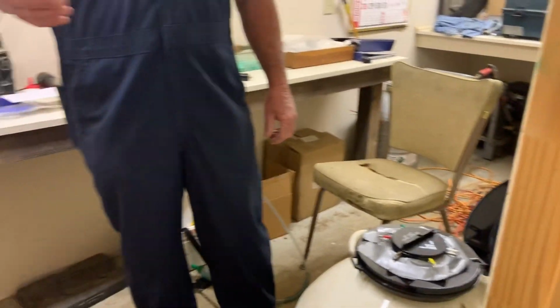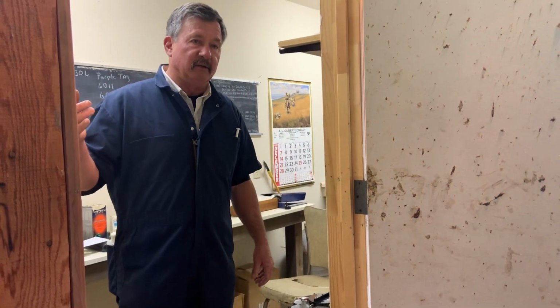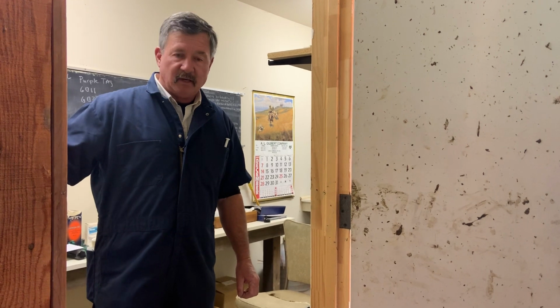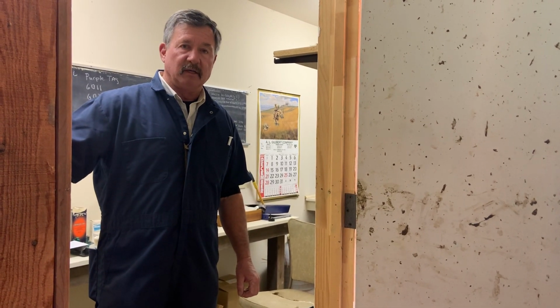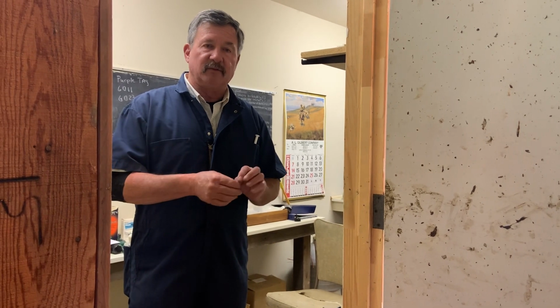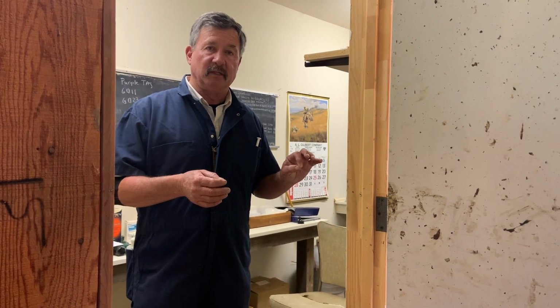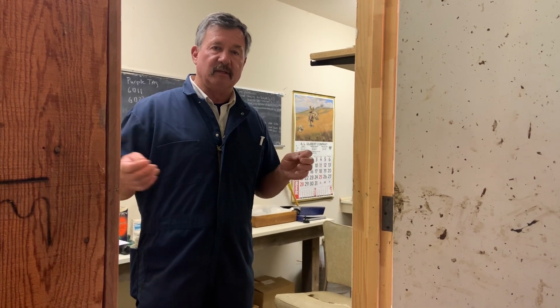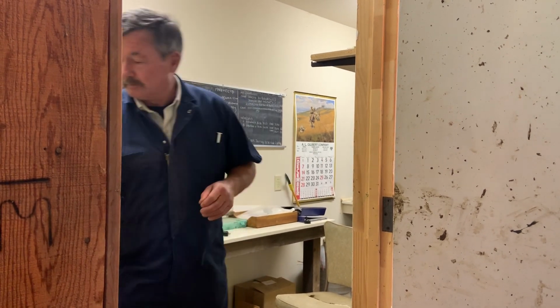So what we're going to do first is go ahead and bring this heifer up and get her ready. Once we get her up into the alleyway here, then we'll go ahead and pull out that straw of semen. We have warmed water that we thaw it in. Once we thaw it, we're going to put it into a sheath to protect it and keep it clean as we do the insemination. We'll load that straw and the sheath into our AI gun.